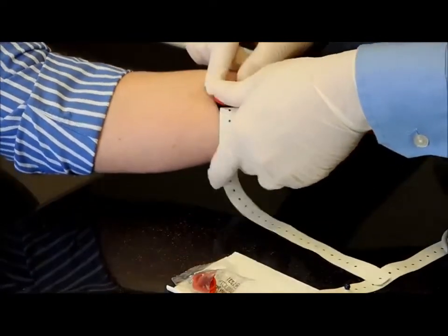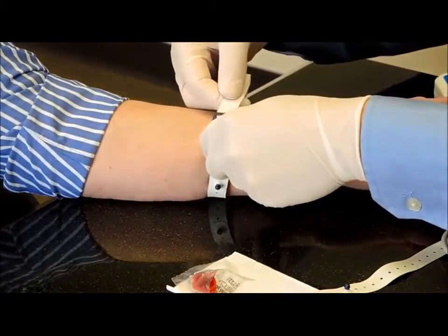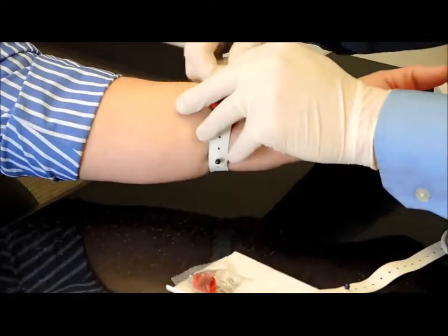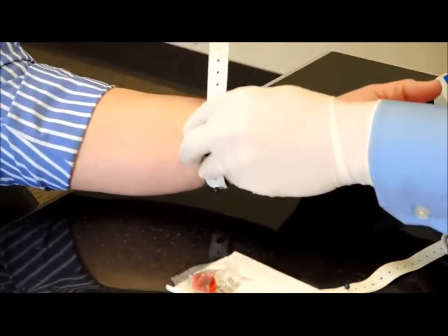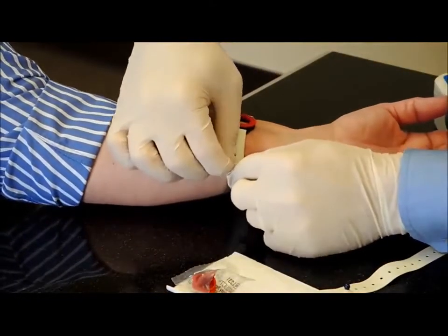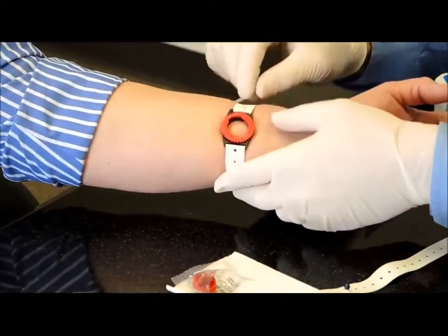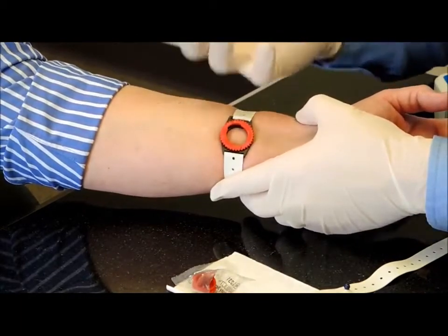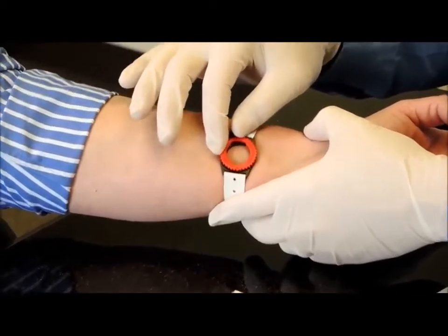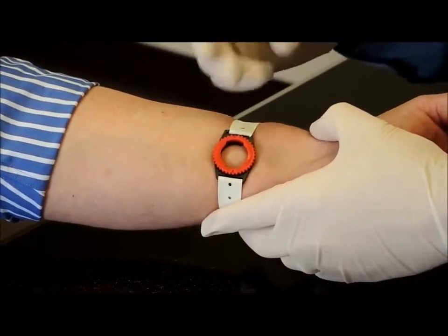And so I'll put the strap on, and I bring the strap around, go through the other side of the connector. Now these straps can stick to the arm a little bit. Then you tighten the strap all the way to the other side and put it back onto the retaining post. You want it fairly tight. You want it so that the skin is kind of pillowed up inside of that holder. That means it's a good tightness, and you want that pillowing effect.